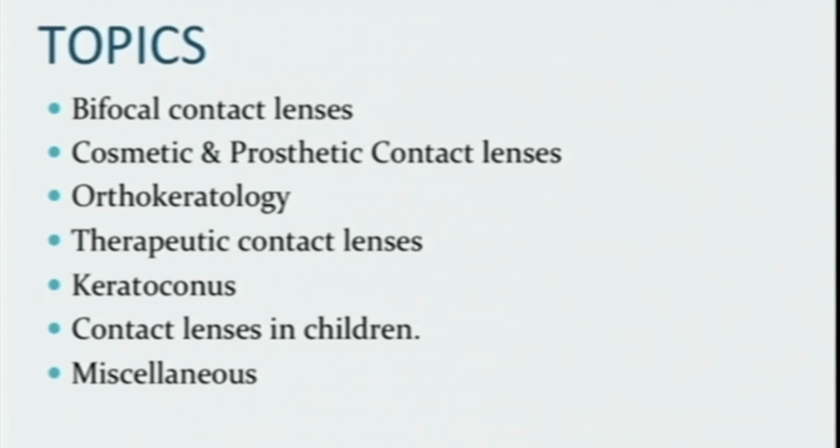One advantage is that. The second advantage is it can be handled by the parents instead of the children. So the visual acuity is maintained throughout the day, and the next day, in fact, for some patients, once in 2 days they use their orthokeratology lenses. It's a rigid lens. There are first generation, second generation, third generation lenses which have come, but in between only plain myopic patients can be corrected with ortho-K lenses.